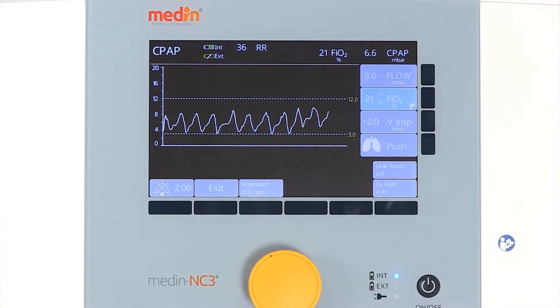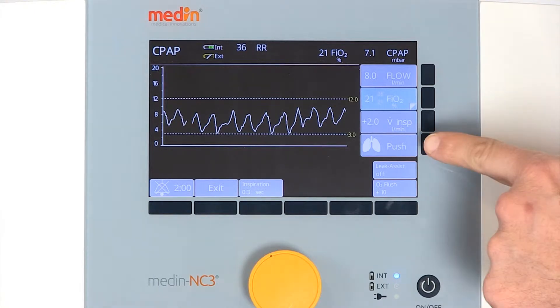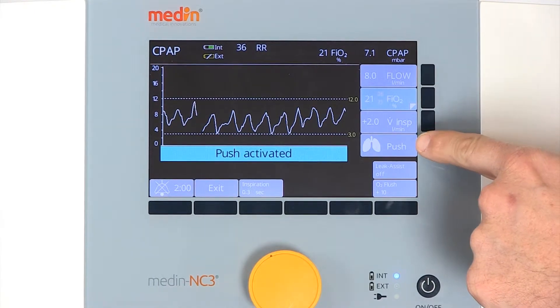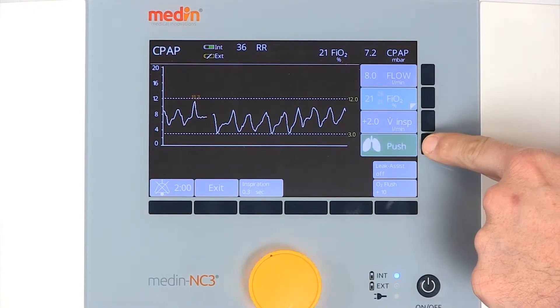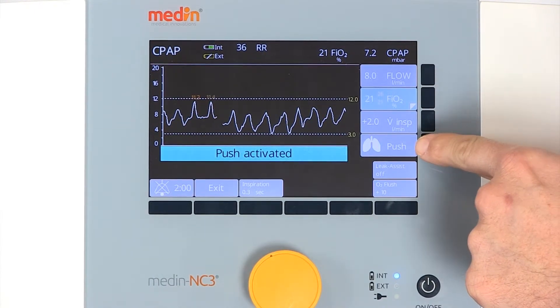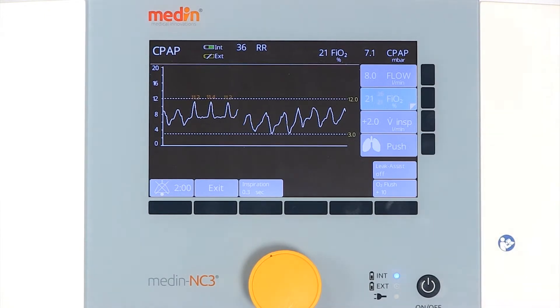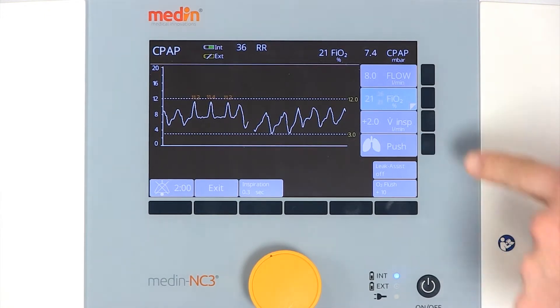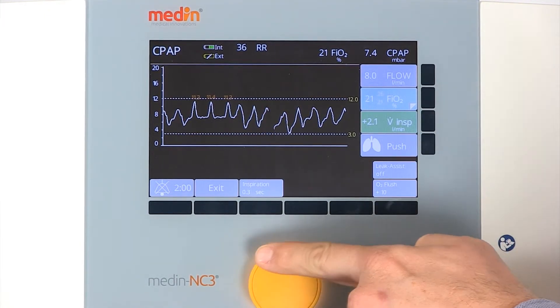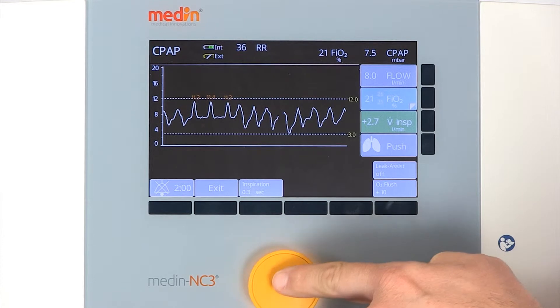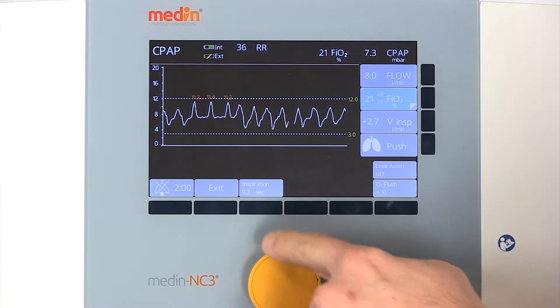You can also apply a manual breath if needed. The pressure and the inspiratory time of this manual breath can be adjusted individually to meet the baby's specific needs.